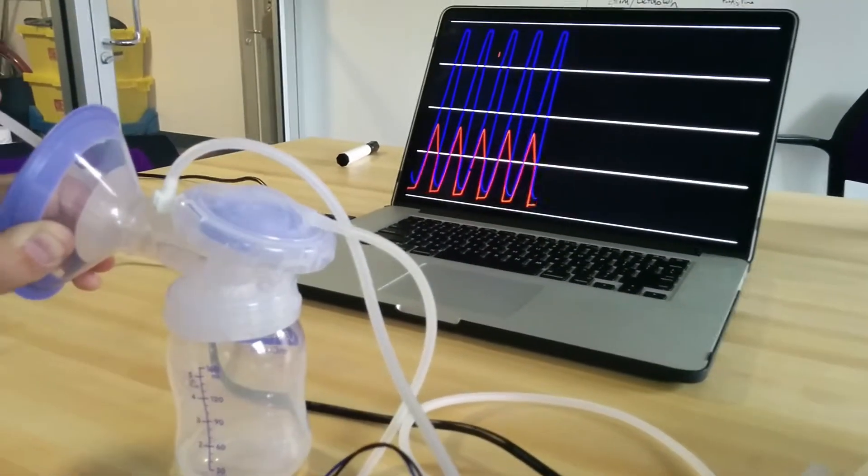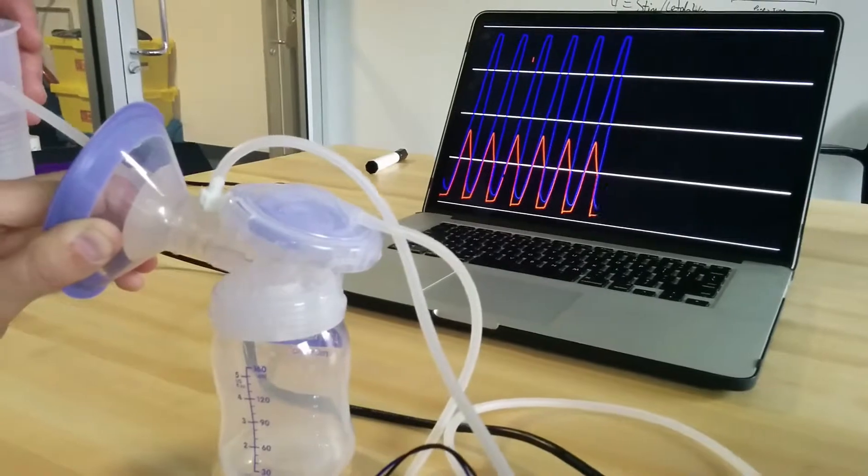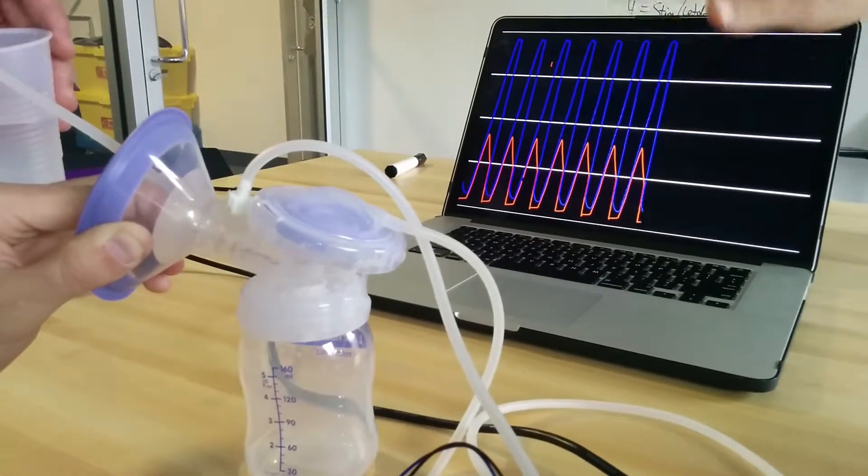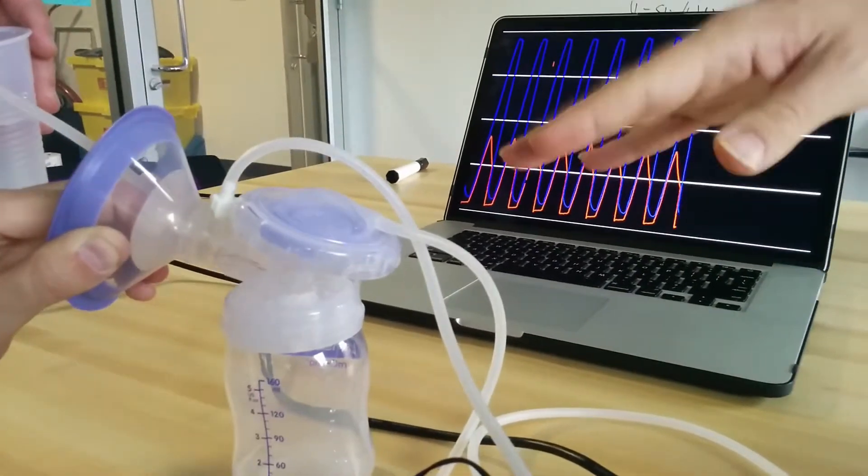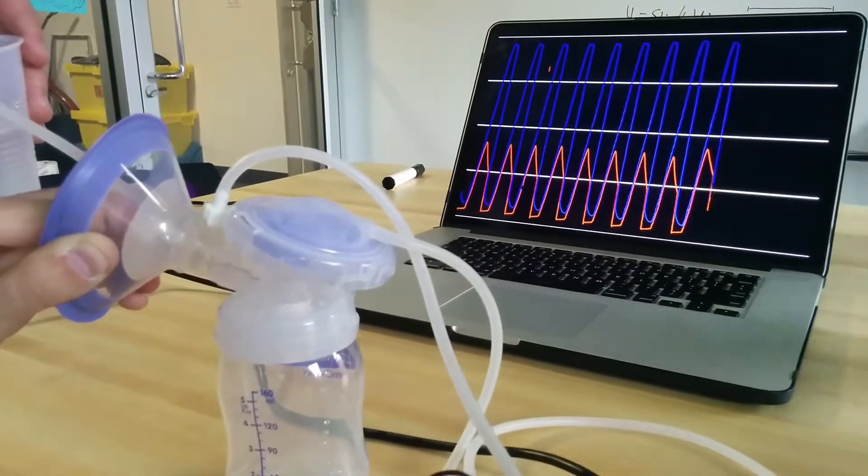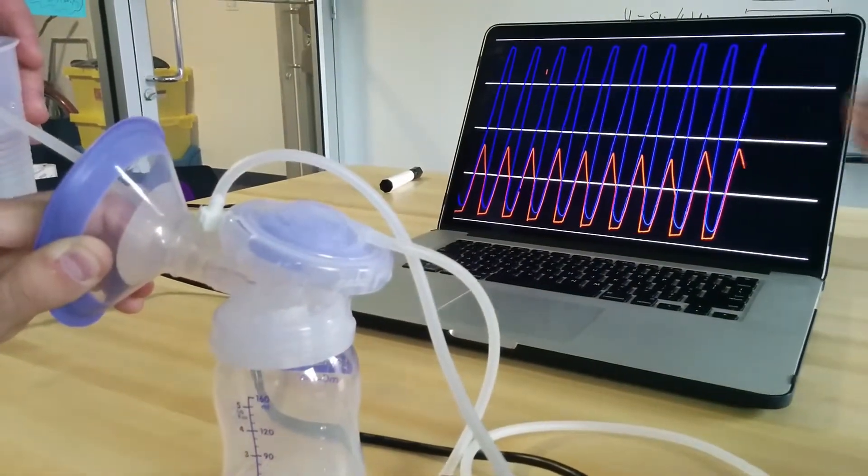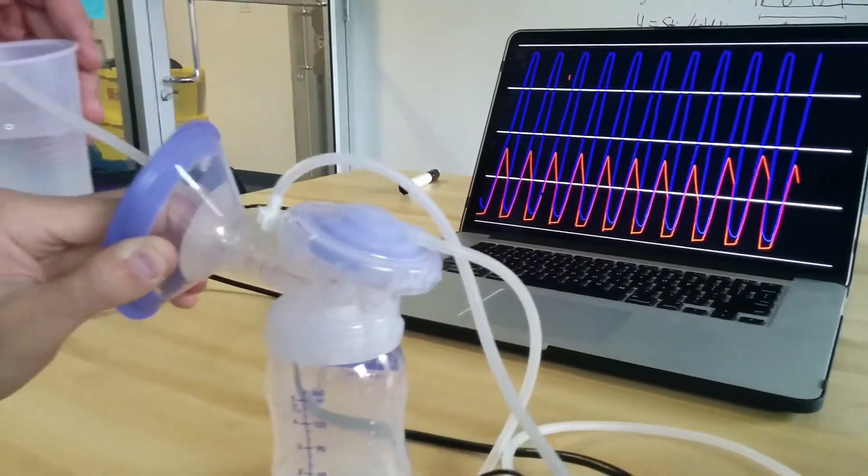At the moment we have a quick connector here, so a perfect seal between the flange and the pump, and that's what the curve looks like.